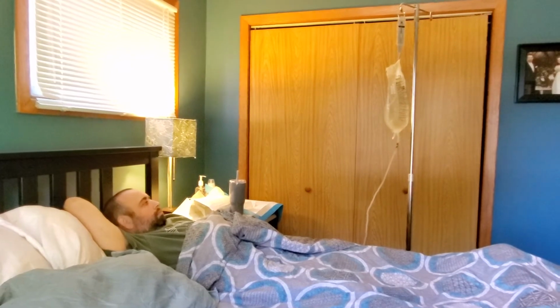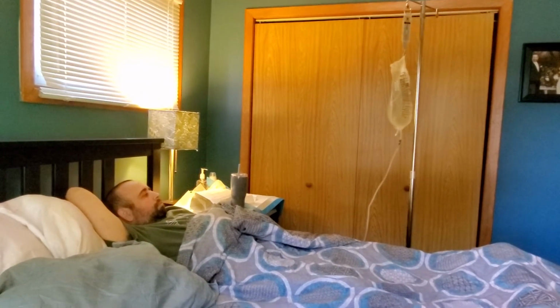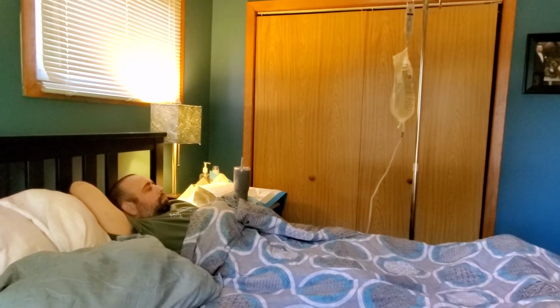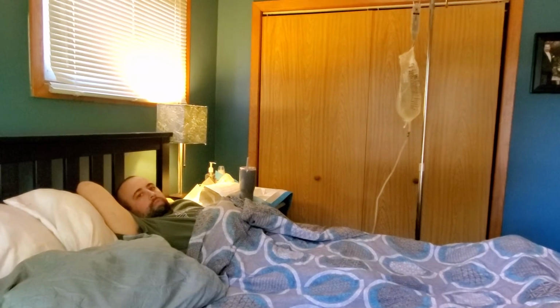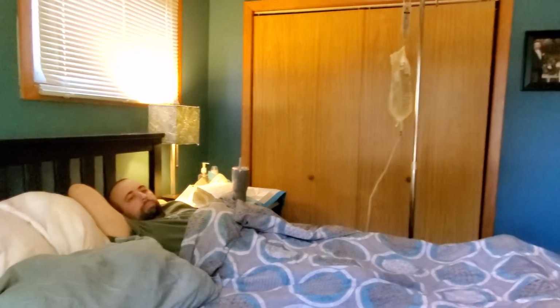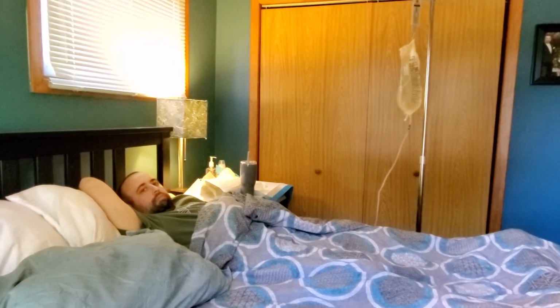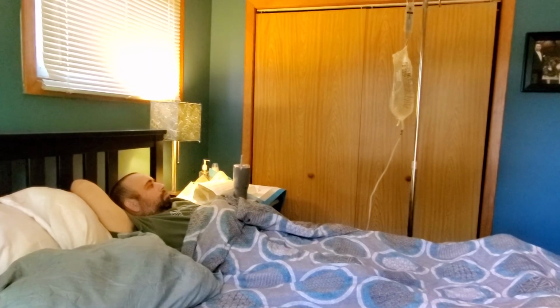So he just lays here with the solution in his body, and then after that we do the drain period, which can last anywhere from 15 minutes to 20 to 30. 20, yeah. Depends on how well it's draining that day. And right now it has been quite painful and uncomfortable for him. So again, hopefully we'll get that figured out. And then that's one cycle.